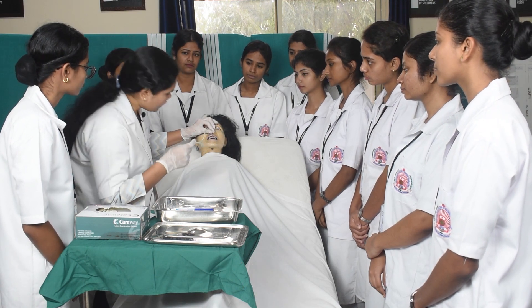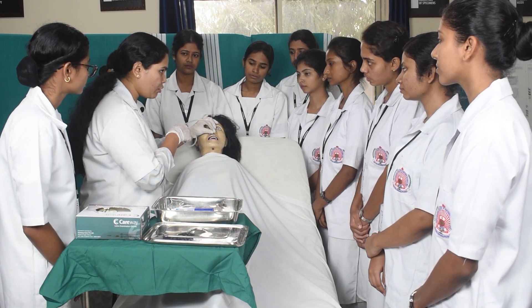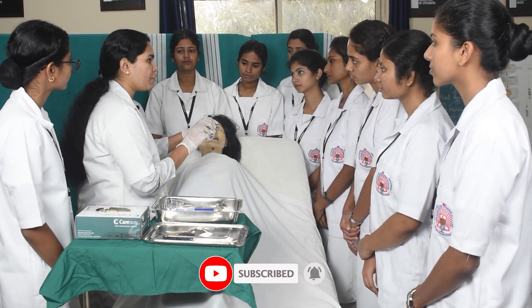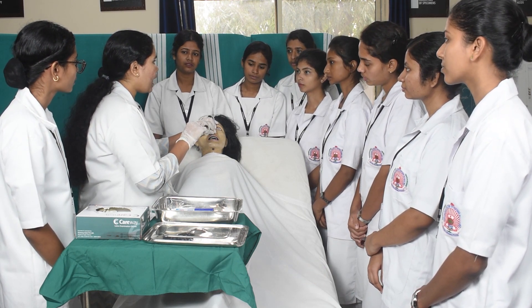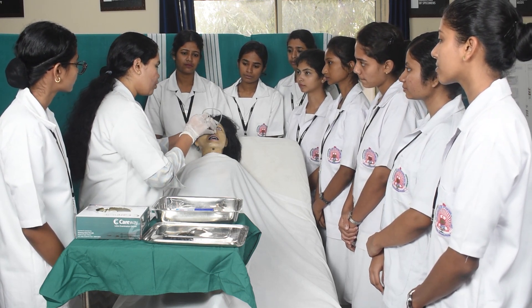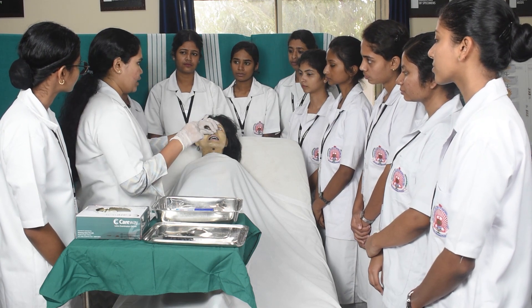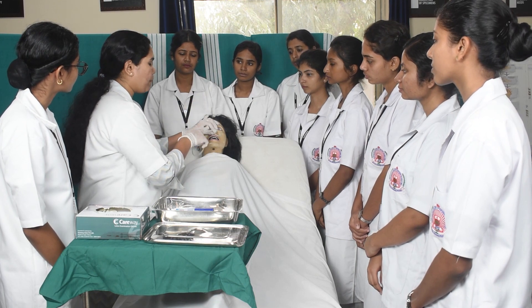Advance the tube up to the markings and check whether the tube is coiled inside the mouth of the patient. The tube is not coiled and the patient is not feeling any distress. If the patient is feeling distress, stop and pull back at least one inch. You can then rotate the tube and gently advance it again up to the markings.